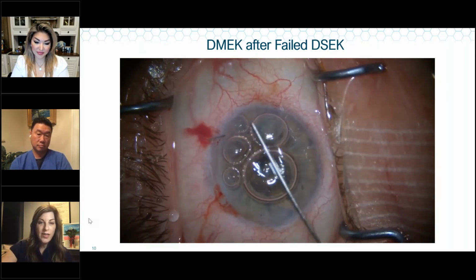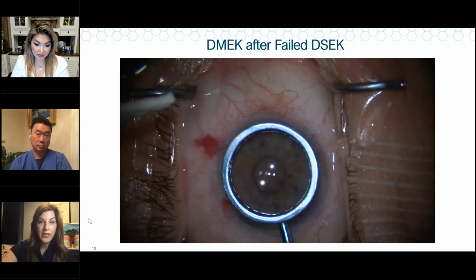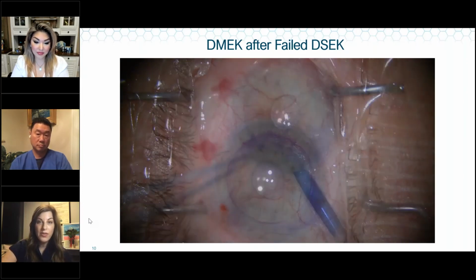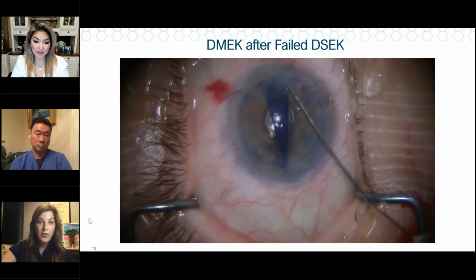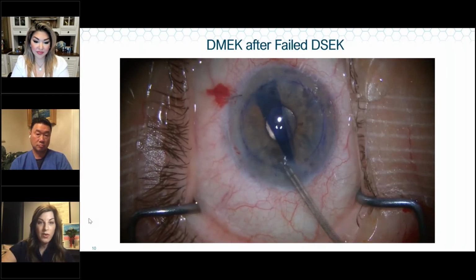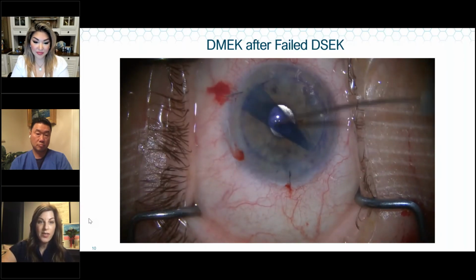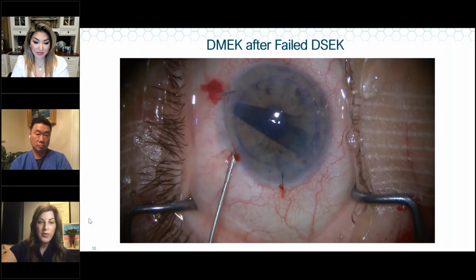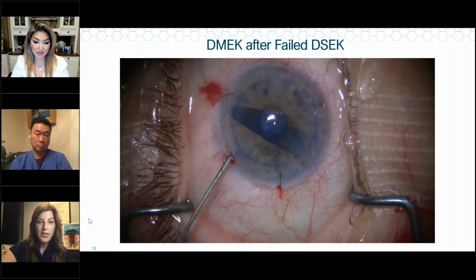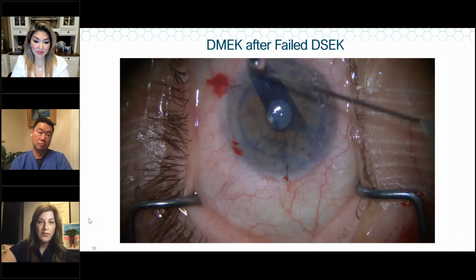And I wanted to see the level of the descemetorhexis because I didn't do the descemetorhexis. So I used air, which is the best contrast, to tell me whether the descemetorhexis was big enough. I wanted to see that it was at least 8 millimeters because I was using a 7.75 graft. Once I inject it, I move it perpendicularly, and then I'm decompressing. I'm realizing that the graft was upside down, so I flipped it.